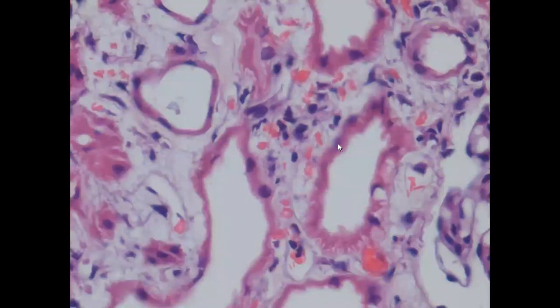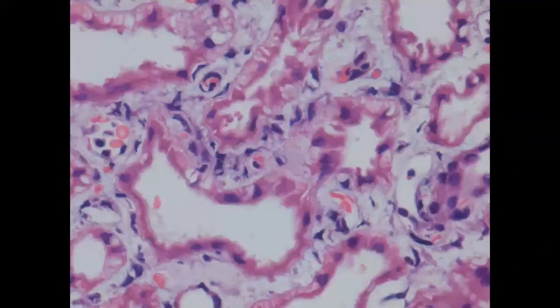Just compare this tubule. You can see the tubular nuclei here, and there is complete flattening of the tubular nuclei, and you hardly see any tubular nuclei here. And you can see these RBCs in the peritubular capillaries. That means there was peritubular capillary congestion, and RBCs are also seen in the interstitium, so there is some interstitial hemorrhage. So ATN has increased. Now, if you look at the PTCs, one PTC, second, third, all PTCs are showing cells. So that means peritubular capillaritis has increased as compared to the previous biopsy. So two things have happened. The ATN severity has increased, and peritubular capillaritis, which was initially very minimal, is now becoming moderate.